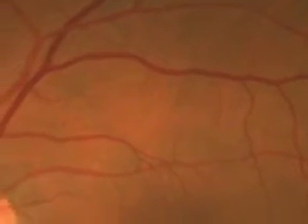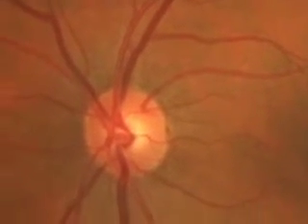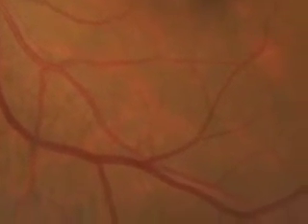Technological advances include the development of instruments that facilitate examination of the retina by non-ophthalmologists. Some of these devices contain cameras. However, these new devices are not yet widely available.